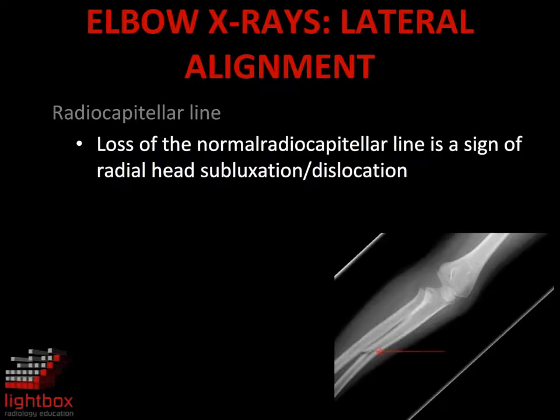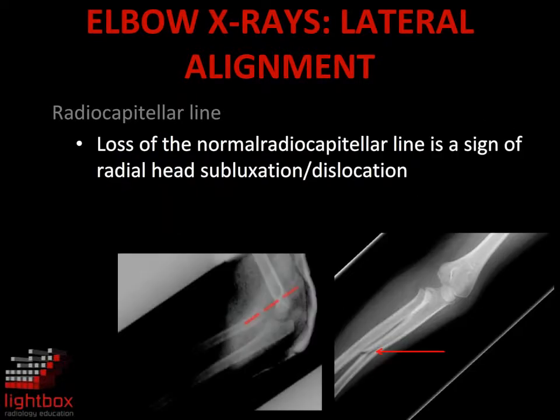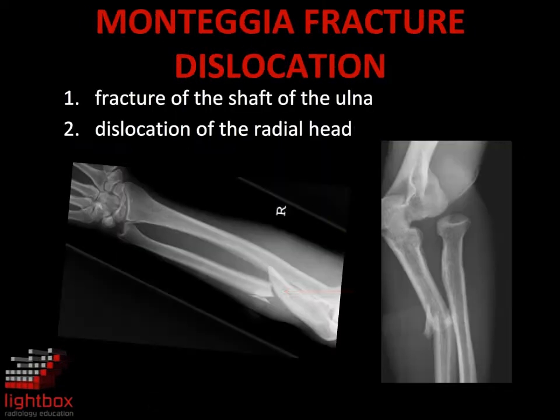Loss of normal orientation on the radiocapitellar line is a sign of radial head subluxation or dislocation. This is a commonly seen association with a fracture of the ulna. This combination has been named Monteggia fracture dislocation.